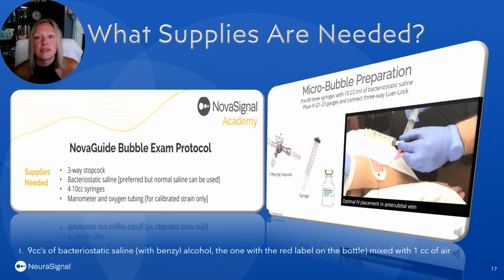Okay, let's get into the supplies that you will need. You will need a 3-way stopcock. You will need some saline. The bacteriostatic saline is preferred, and you will need 4 10cc syringes.